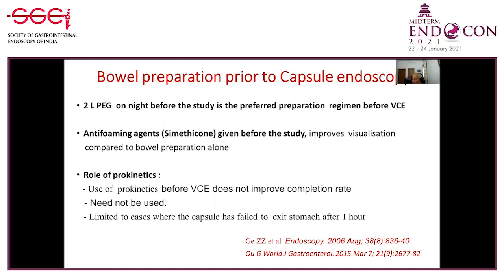When the battery life was only about 8 hours, completion rate was not so good. So prokinetics were used to help in better completion rate. But now with the battery life of about 12 hours, there is no need to use prokinetics.